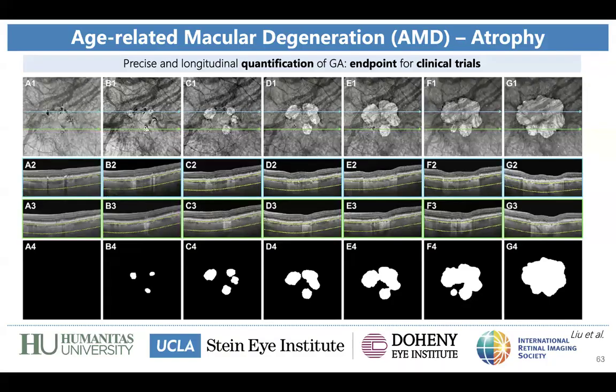Of course, for clinical trials there will always be limitations in this sense. It will be very difficult to address all these points for different patients. But I think studies comparing different slabs for different lesions will be of very high value for future research.